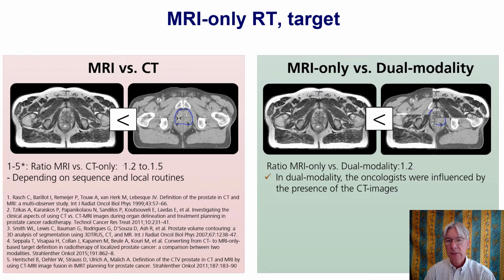And we think that the reason for that is that doing the contouring, the oncologist is actually using both the CT information and the MR information in the combined workflow, and the volume will then be larger, in our case 20%, because there is some misalignment in the image registration, and there's also difference in the anatomy.